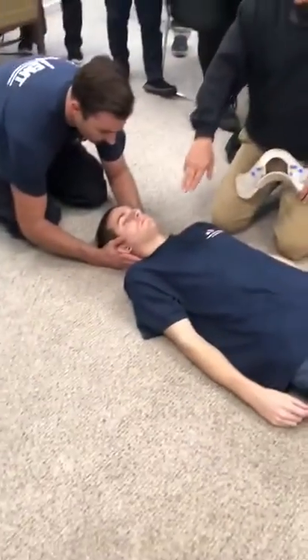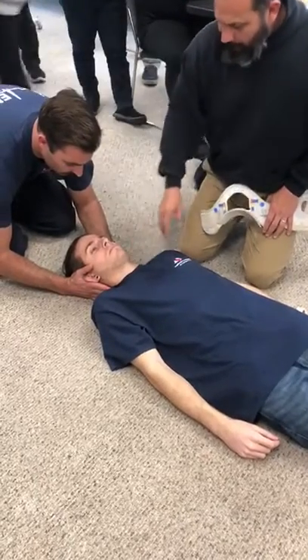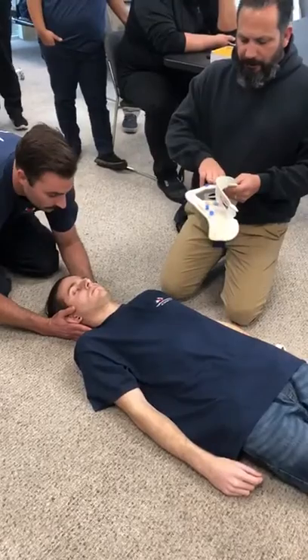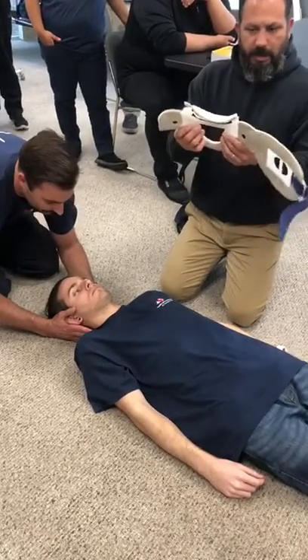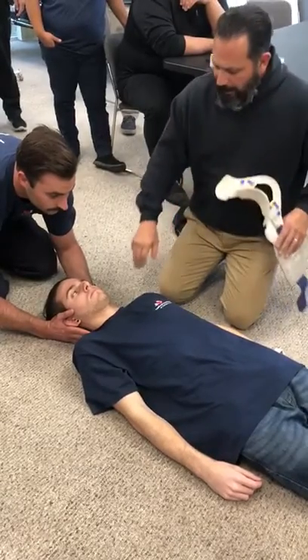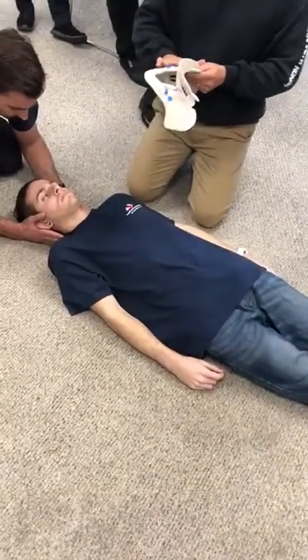I grab my collar and I'm going to demonstrate how to measure. You measure between the mandible and the top of the trapezius, come over here, adjust it, and set it accordingly. He measured it — trapezius to the angle of the jaw — then came over to the size line and measured accordingly.